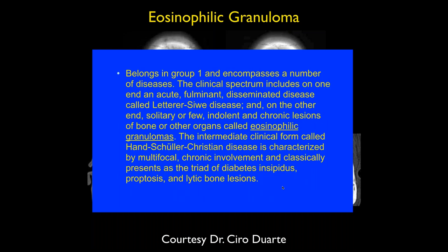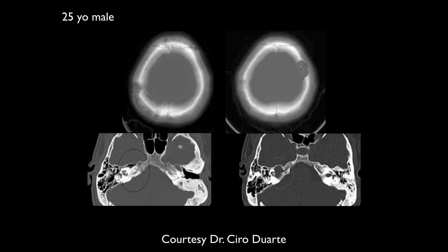Okay. Is it just that one area, John? Well, this one has three areas, here, here, and down here. How about the center? I see a lucency in the center, but I don't know where that is. Left upper. Up here, there's this one. Yeah, the center and posterior. And through here? Yeah. Okay, yeah. I wonder if it's throughout the whole. In fact, I see more anterior too.